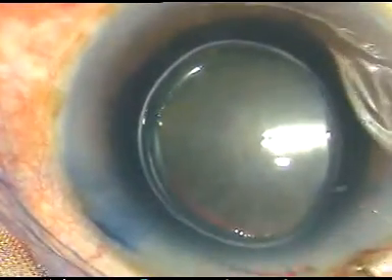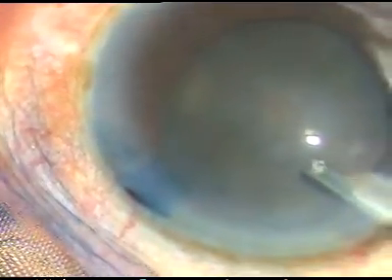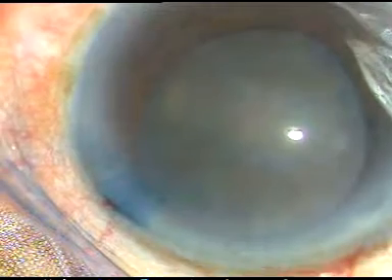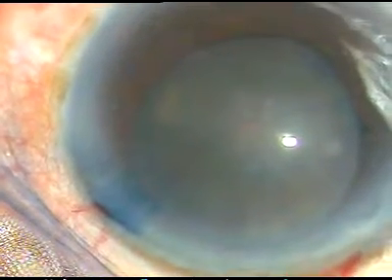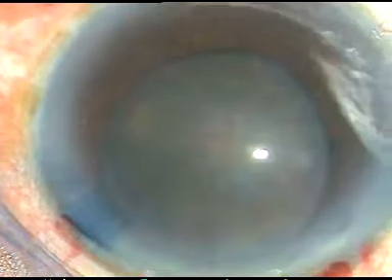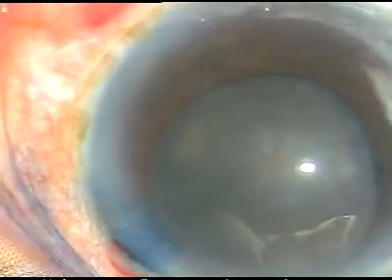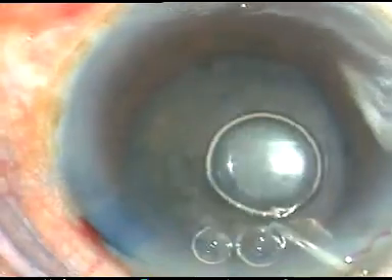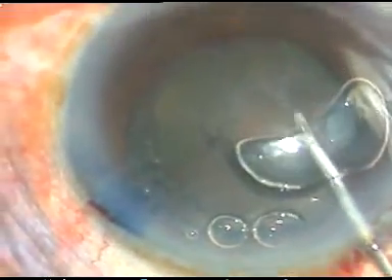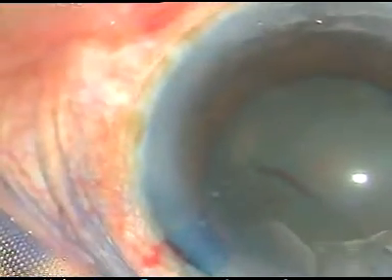And if posterior capsule rupture occurs, I can put a lens in the sulcus. In that case, the stained anterior capsular rim will be easy to identify. In this case, I am going to use Viscoat — this is Viscoat from Alcon.